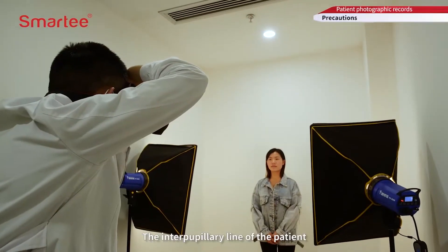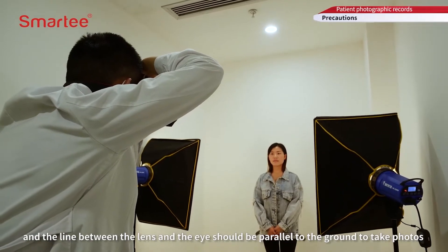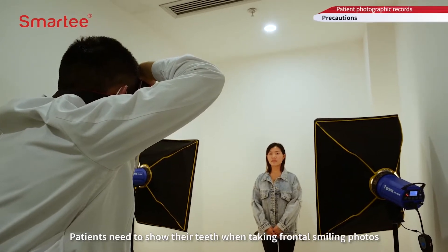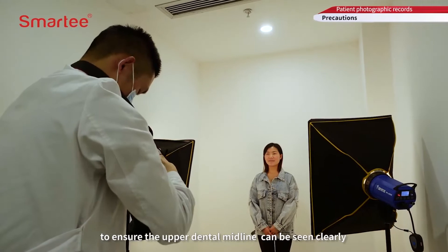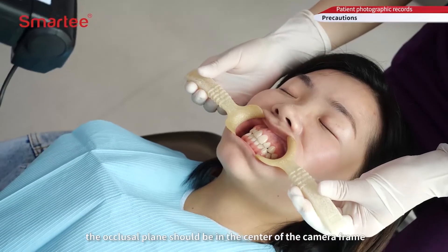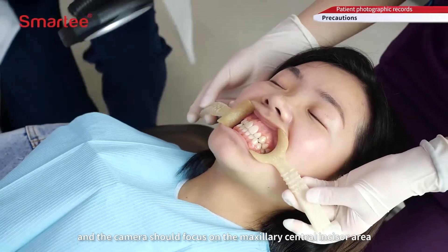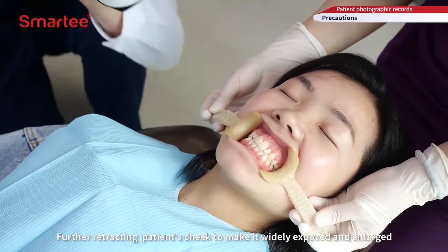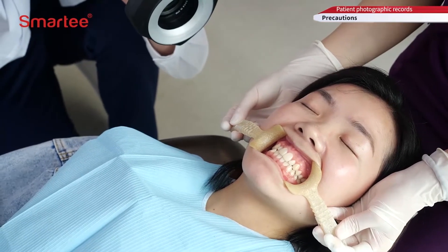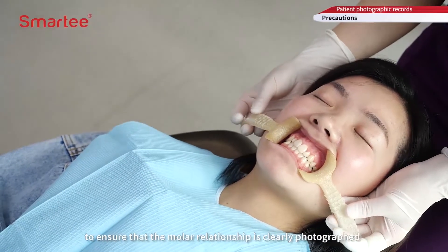The interpupillary line of the patient and the line between the lens and the eye should be parallel to the ground to take photos. Patients need to show their teeth when taking frontal smiling photos to ensure the upper dental midline can be seen clearly. When taking anterior frontal photos, the occlusal plane should be in the center of the camera frame, and the camera should focus on the maxillary central incisor area, further retracting the patient's cheek to ensure the ideal buccal view. The canine area should be focused on to ensure that the molar relationship is clearly photographed.